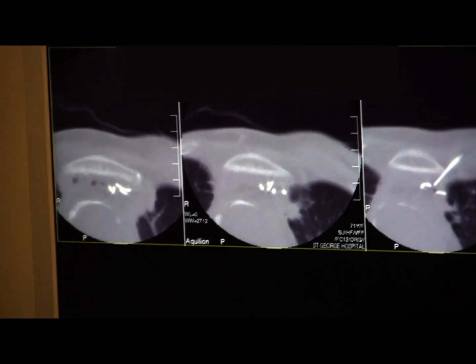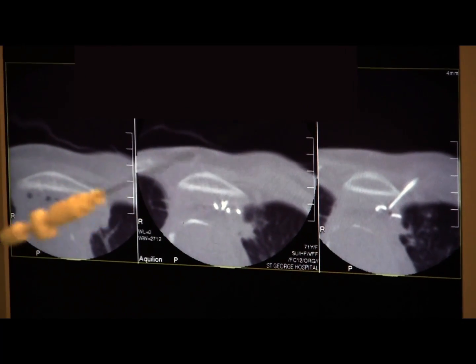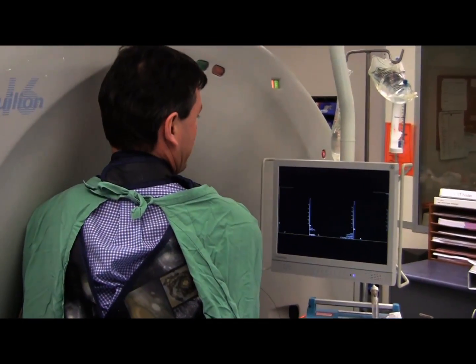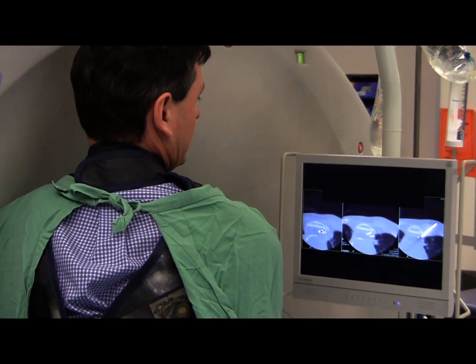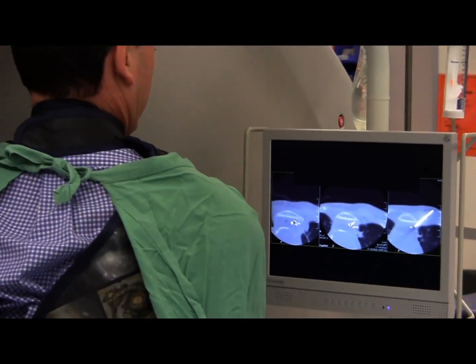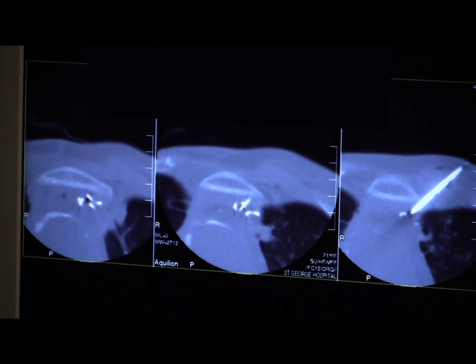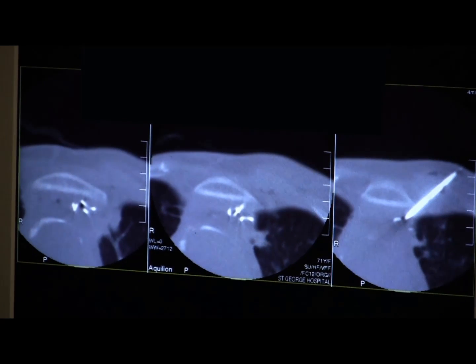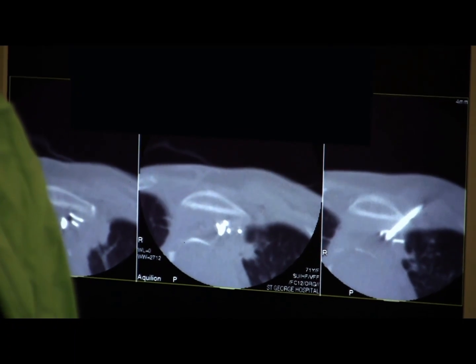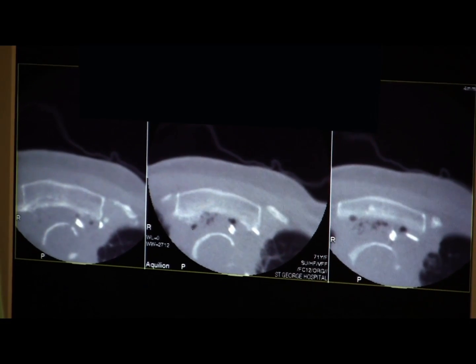And now the moment of truth. So we can actually get the drain to follow where we need it to go today. Get the drain to inch past the back edge of the sternum there. You can see our drain now running towards the area we want, so we'll just rely on the guide wire now to assist the drain to run up to where we want to go. You can see the drain is starting to form up following the guide wire in the collection behind the sternum.